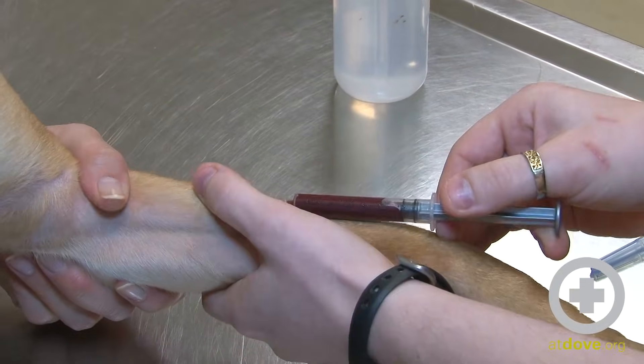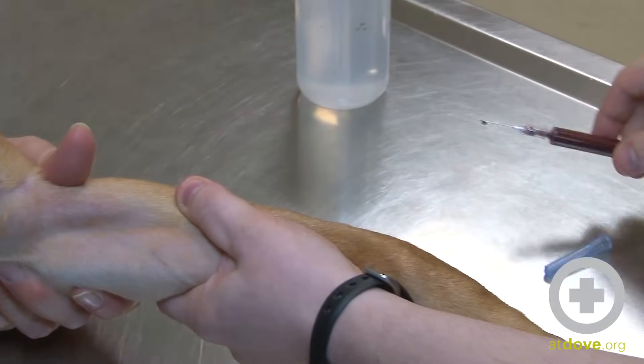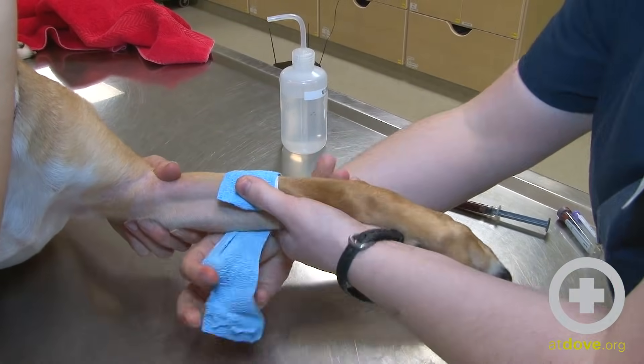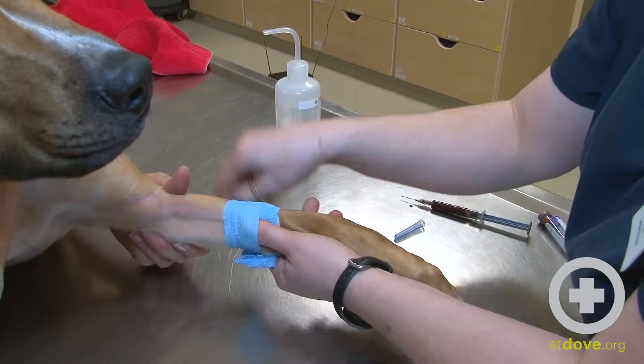Okay, and when I'm done, she's going to let up. I'm going to pull out, put on my band-aid, and then I can put my blood into my tubes. And that's how we draw blood from a cephalic vein here at Dove Lewis. There you go. Thank you.